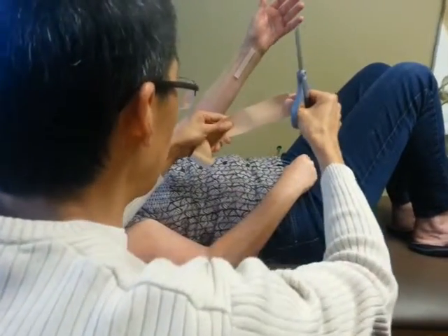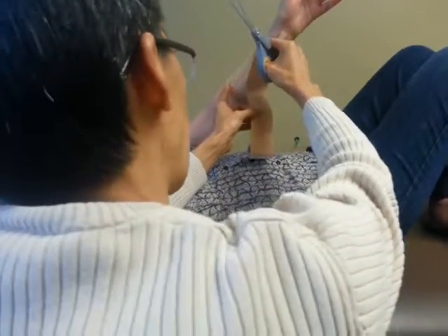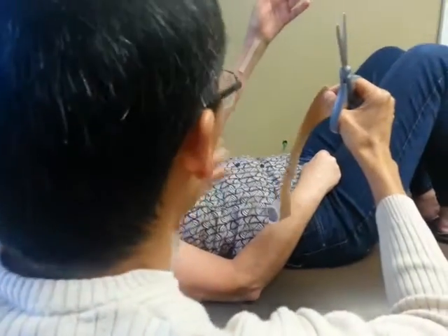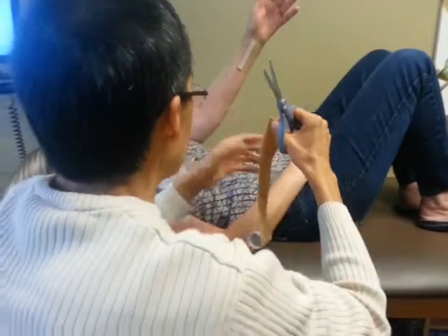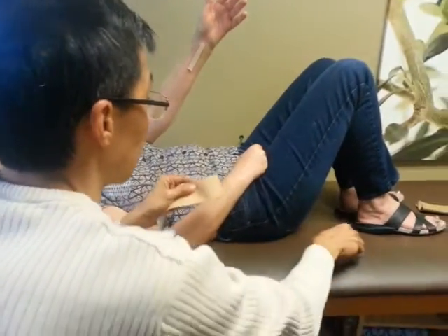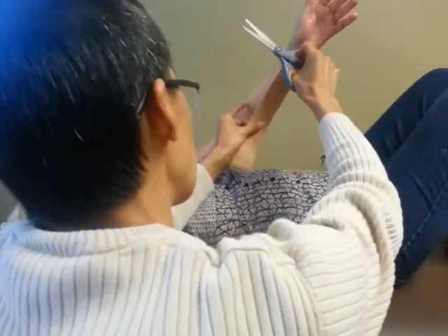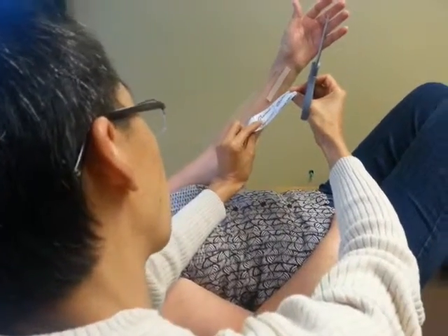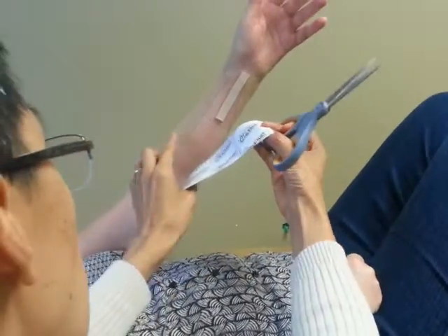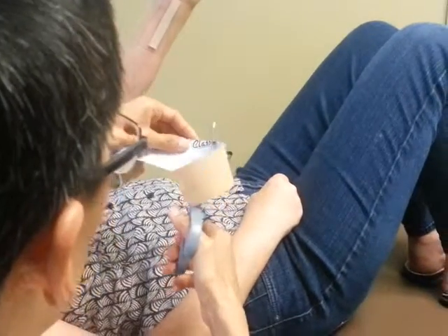If you're going to do one that needs to be this long, the original tape was actually about this long because I stretched it out. So the more the stretch, the more the pull, and it will actually sometimes have a better draining effect. I would stretch it at least 20 to 30 percent — you can actually stretch it to 50. So if you're going to stretch it 50 percent and it's going to be this long, you need to cut it about this short. I'm going to cut it about two and a half blocks.